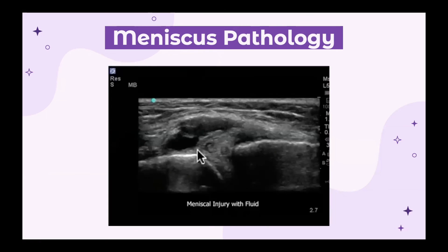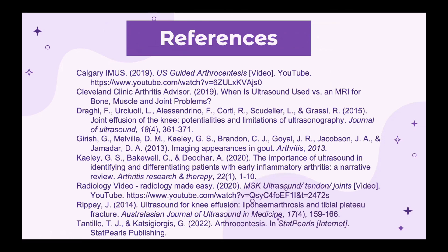Here we can see the femur and tibia with the meniscus in between. You can also see effusion here because of the displacement of the meniscus, and there are cysts present in the meniscus as well. Certain zones of the meniscus are not visible to ultrasound, but we can see parts of what is being affected. There are many more pathologies that ultrasound can detect within the knee and other joints, showing just how useful ultrasound can be in the diagnostic and procedural process. Thanks.